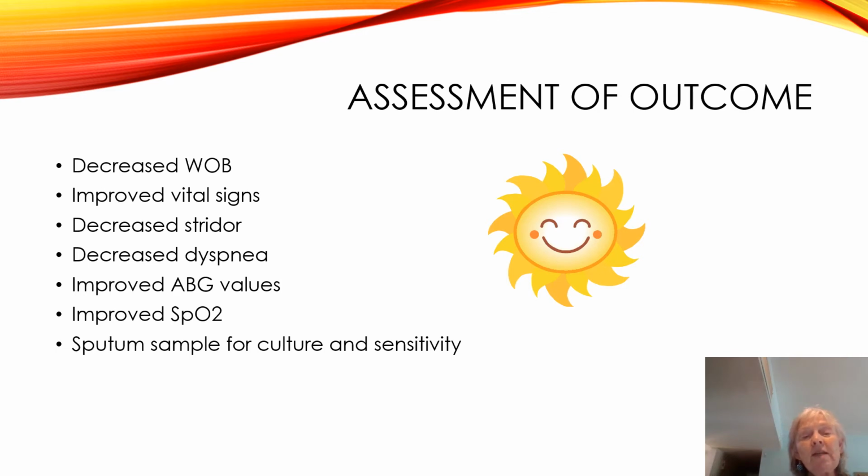When we get sputum samples, if you remember when we talked about humidifiers and we have to fill them up, especially our heated humidifiers, I told you if you have a bottle of sterile water, it has to have the date, the time, and your initials on it. With your sputum sample, guess what? You have to label it with the patient's name. Make sure that you can grab one of the labels, the room they're in, the date, the time, your initials, and why are you sending it down to the lab to be cultured?